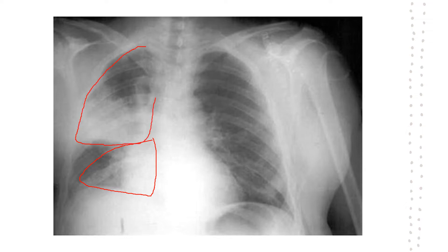In the X-ray, what you are actually seeing is a non-homogeneous opacity in the lower half of the right upper lobe. The upper part appears relatively clear, but the lower part is fully dense. This is non-homogeneous because you can see small black spaces inside, which could indicate an air bronchogram. So this can be interpreted as consolidation of the right upper lobe.